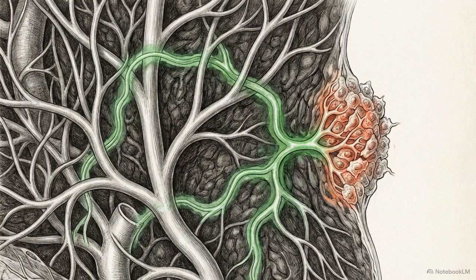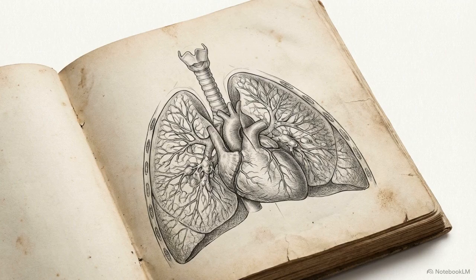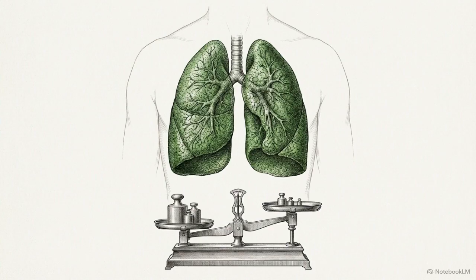Gallium imaging abandons the physical constraints of size and flow. Instead, it hijacks the body's own microscopic iron transport pathways to uncover hidden sites of inflammation. To extract a specific diagnosis from a nonspecific tracer, clinicians evaluate the geometry of the uptake. We look for established structural patterns of accumulation. For example, gallium is used to evaluate active sarcoidosis. The clinical standard for active disease is observing pulmonary gallium uptake, graded significantly higher than surrounding soft tissue.